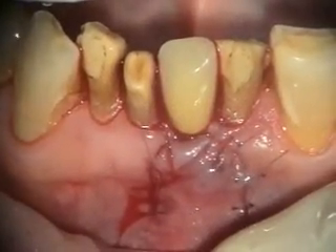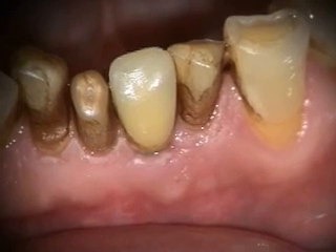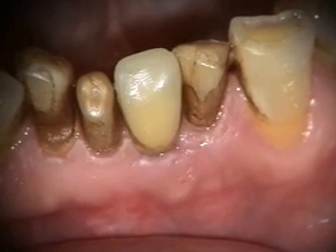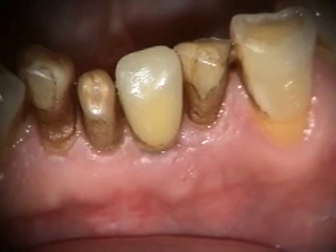We'll take a look at this in a couple weeks. This is the two-week healing of the implant repair we did on tooth number 24. He's got a lot of Peridex stain or chlorhexidine stain that we're going to polish off. But everything's looking really good.